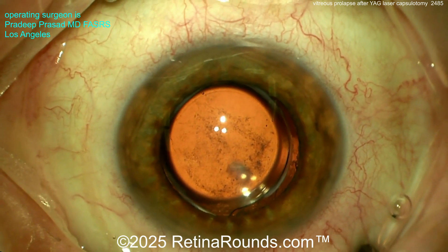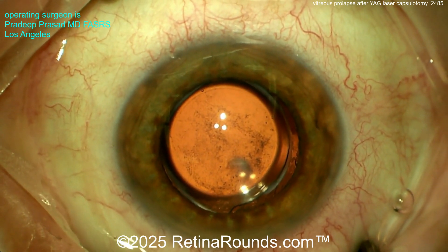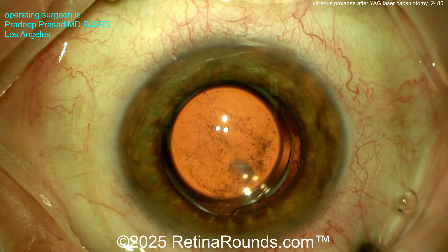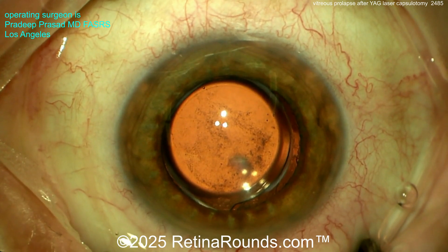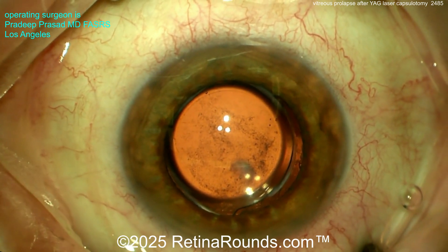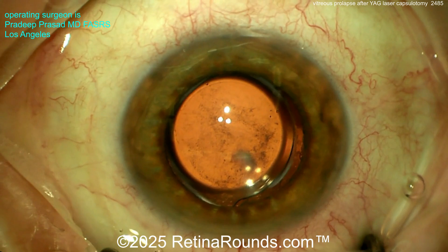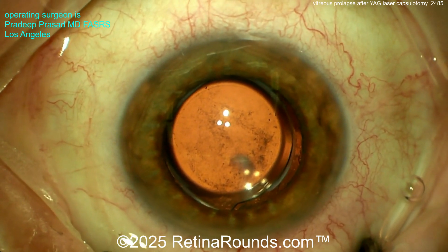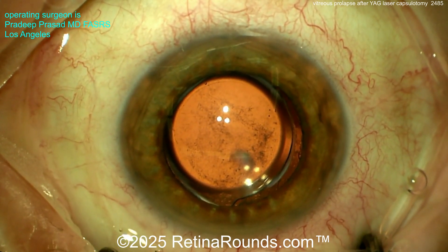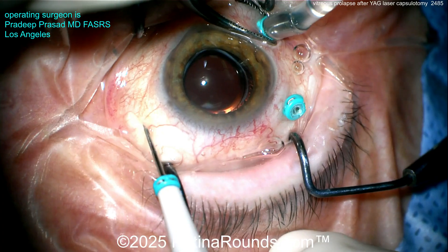Here you can see the patient — you can appreciate the vitreous that's in the anterior chamber. If you look a little bit deeper, you can also see some remnants of the patient's posterior capsule floating there in the anterior vitreous. This is causing the patient a lot of symptomatic floaters.